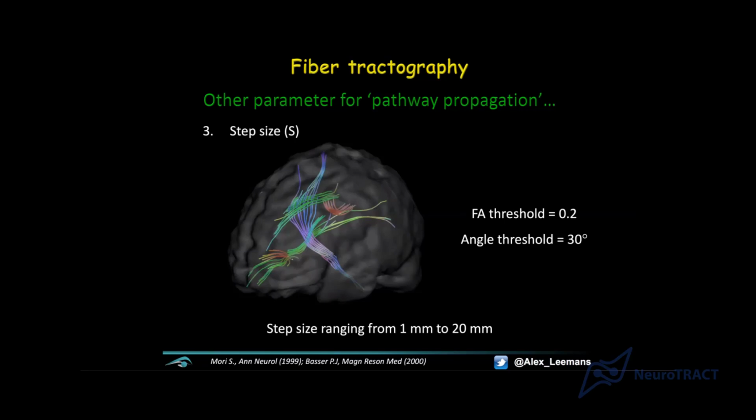Okay, so yes, you can choose, but there's a trade-off practically and also methodologically, meaning you can't just say, I want a data set with a resolution of 1 micrometer, because there won't be enough signal in your voxels. It will be mostly noise. Okay.